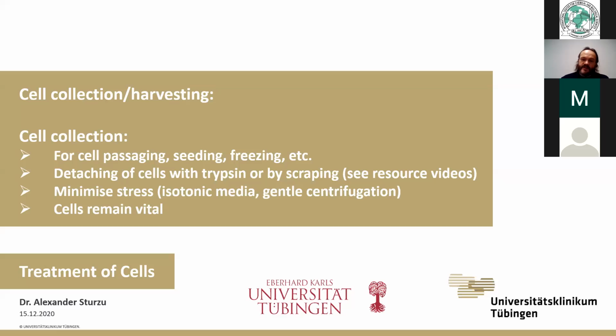And for this, you should have seen the videos yesterday. And what's important at this stage is to minimize the stress on the cells by making sure to use isotonic media, do not give them any osmotic stress, and be careful and gentle with the centrifugation to not expose them to too much shearing force and too much of this centrifugal force.